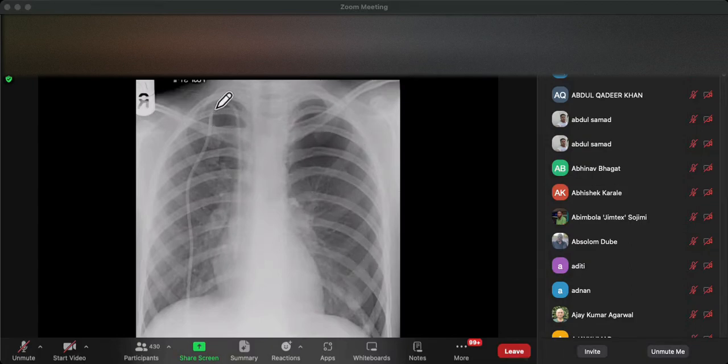So this is a Hickman line for the treatment of a malignancy, and the patient is presented with a pneumothorax because they've got an osteosarcoma met. Now, osteosarcoma mets are very, very common as a cause of a bronchopleural fistula. And what they do is they introduce gas into the pleural space because of this bronchopleural fistula, and they present with a pneumothorax.